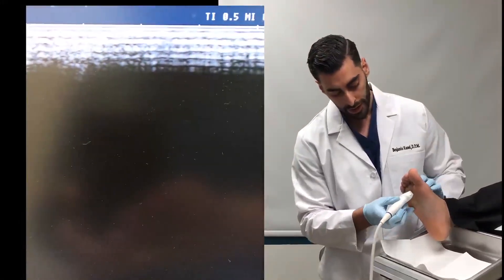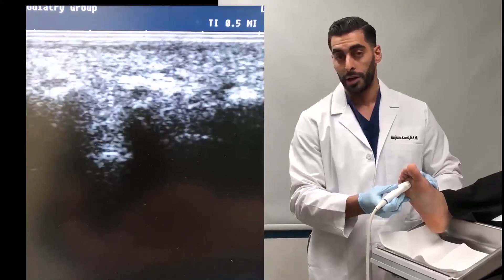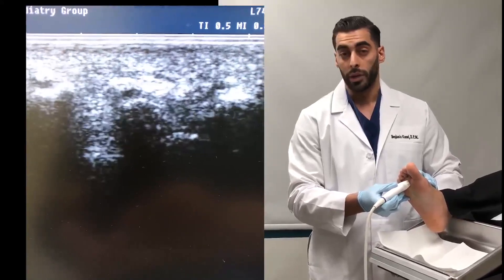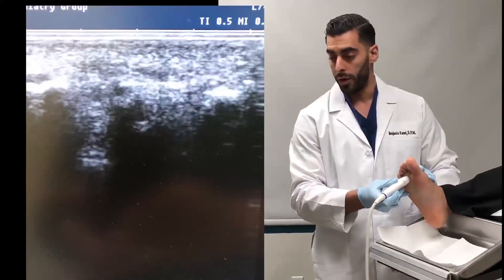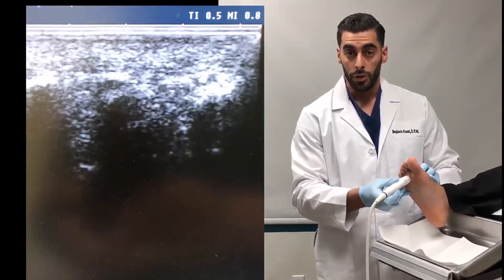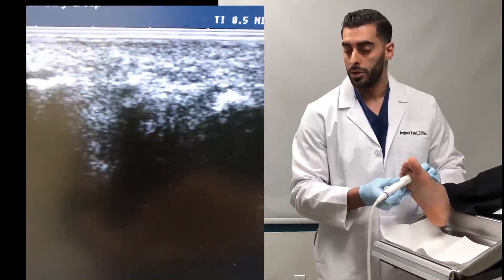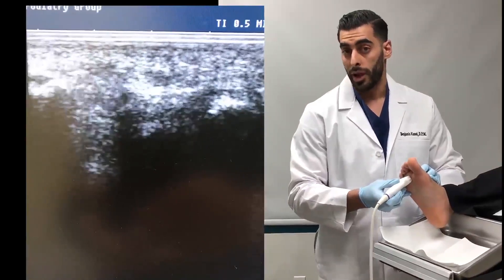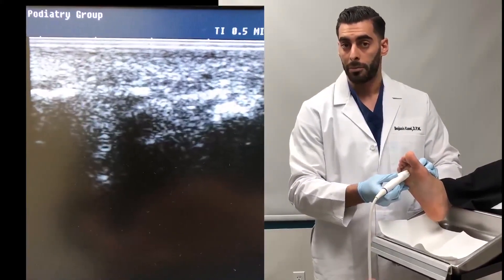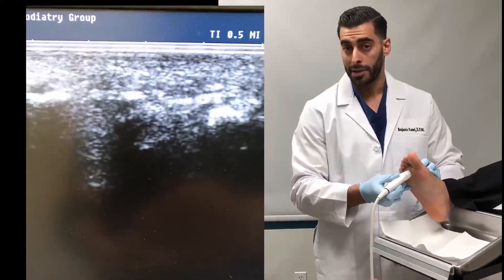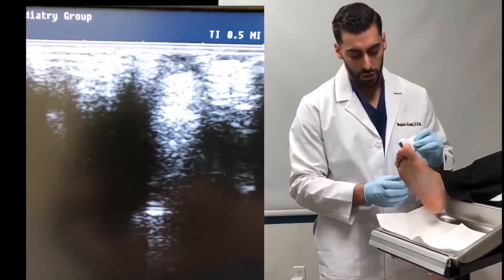Now we're going to do it again in the transverse view. What's great about the transverse view is that you can see the relation of the intermetatarsal fat in relation to the different metatarsal heads. As you can see here we have the three metatarsal heads — three, four, and five — and you can see the uniform hyperechoic fat in between the metatarsal heads. Now if we were concerned about a neuroma, we will see a hypoechoic mass that replaces the hyperechoic fat.